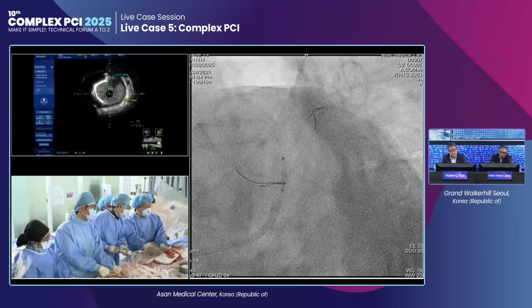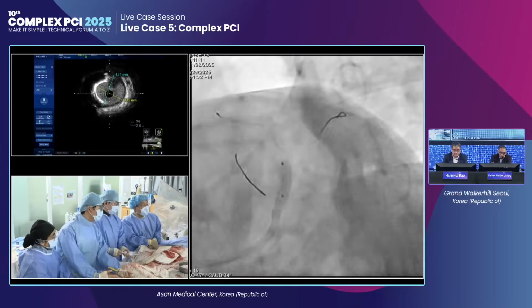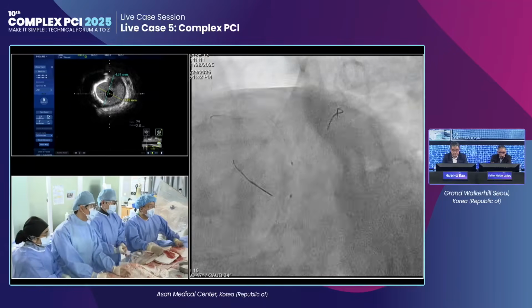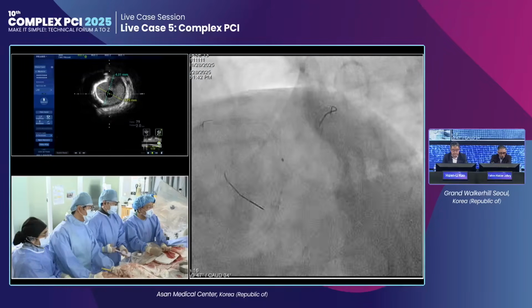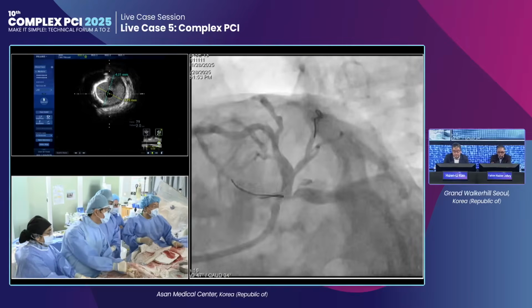Inflate. We don't need any more hesitations. All right. Nominal, 16. So it opened up very nicely, that's good. Inflate. All right. This is 1 minute. Okay. Take a picture first and then full shot.